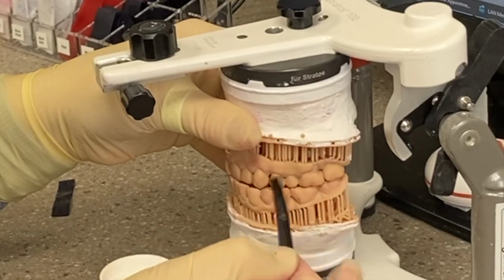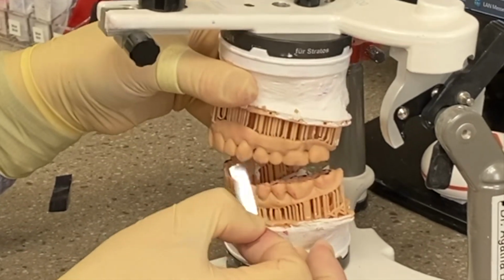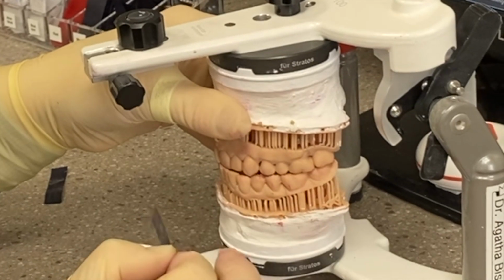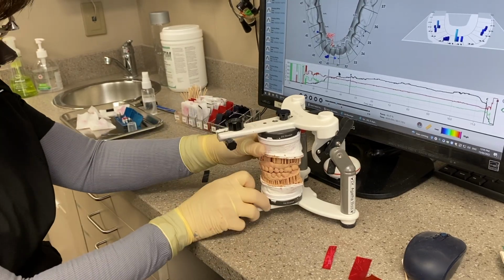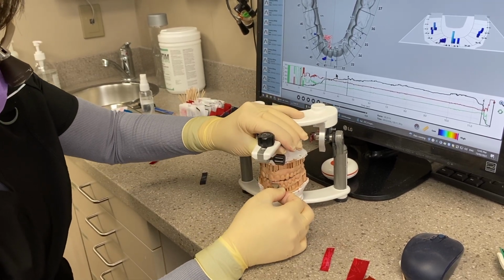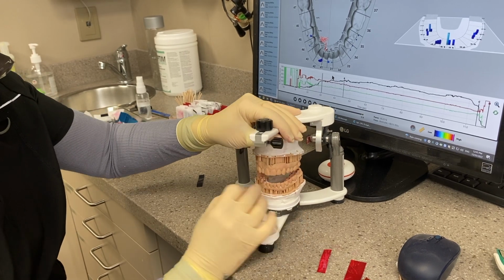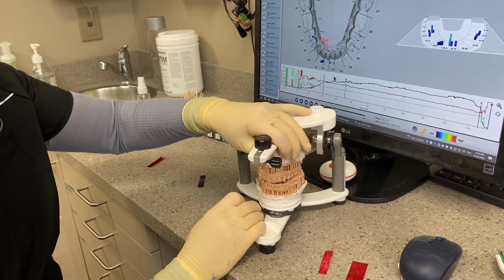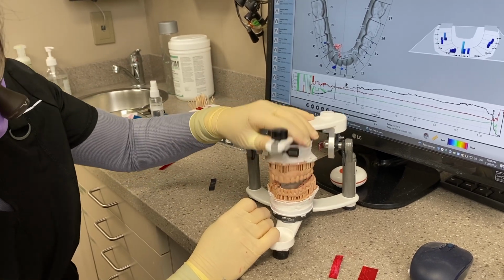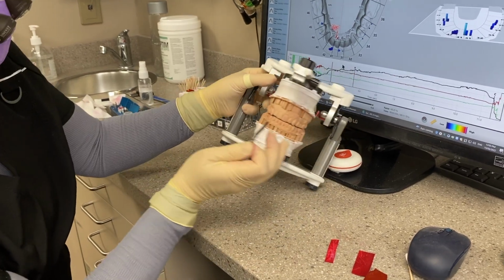Okay, I'm on the canine. We did it. Now it's kind of a crappy spot, but I would have liked to see it in a different position, but we're there. So let's see how the front feels. So she's hitting on the central here and on the canine. So the question is, will she go that far? And I'm going to test it, but I probably won't adjust here because there's no point. The likelihood of her going that far is low.